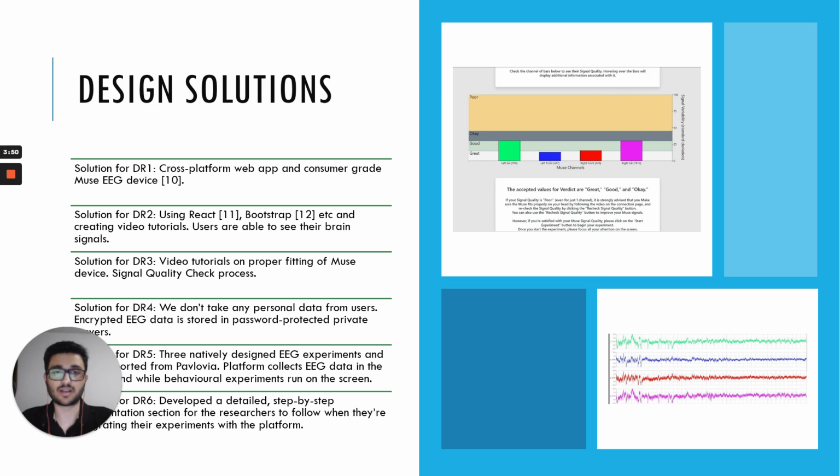To increase the visual appeal of the platform and engageability, we use certain frameworks such as React and Bootstrap, and we also created video tutorials for the platform so that the participants know how to use it. We also let the participants see their live signal in real time.